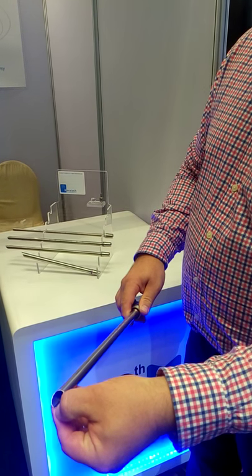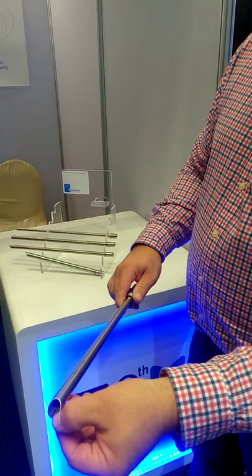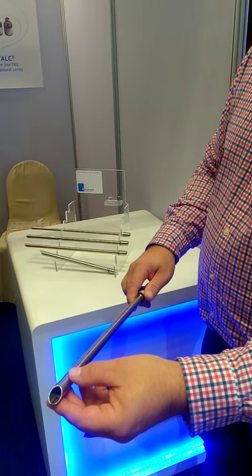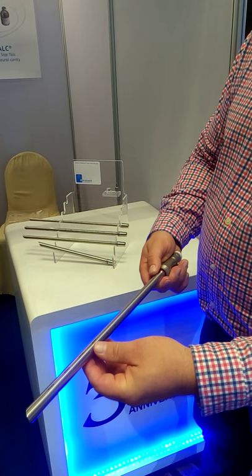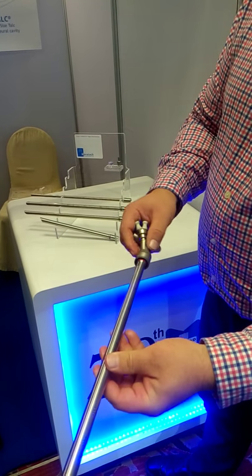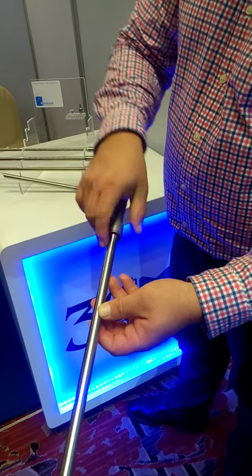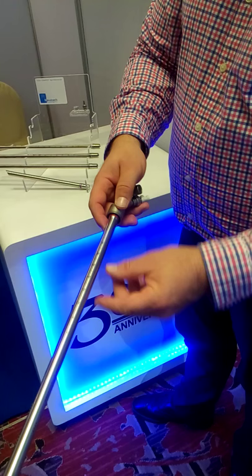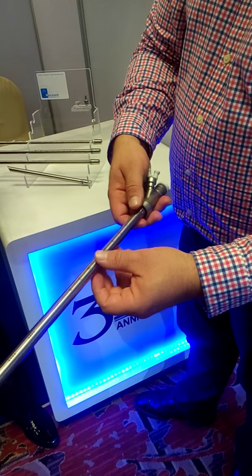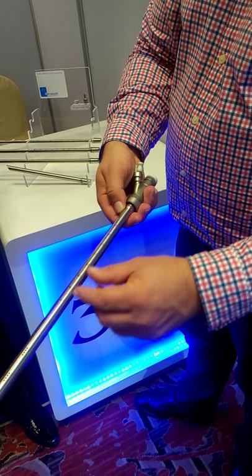You also have a black line inside, which is new — it shows you, for the optics, how far at the beginning of the tube you already are. We also have holes on both sides for ventilation. And also new is that we have two markings: on one side it's uneven, and on the other side it's even markings. With this, you can determine the length of the stenosis — either even or uneven — and it also shows you if it's the top or the bottom of the tube.